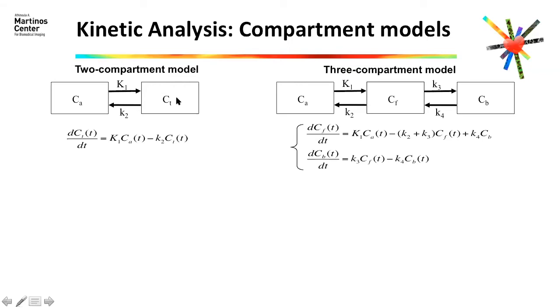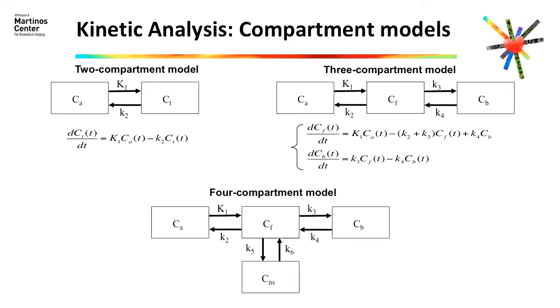And it can also cross back into the blood pool, and you can add more and more compartments, modeling, for instance, the specific receptors versus the non-specific receptors, or the free or unbound tracer. You can have even more if the non-specific is different from the free. So you can increase the complexity. Obviously, the more complex, hopefully the more accurate it is, but the more challenging it is to fit all these parameters.